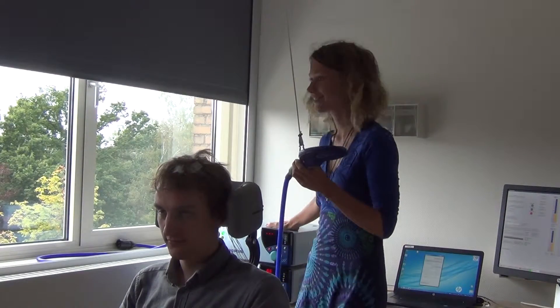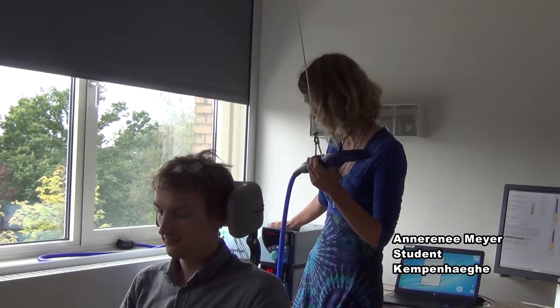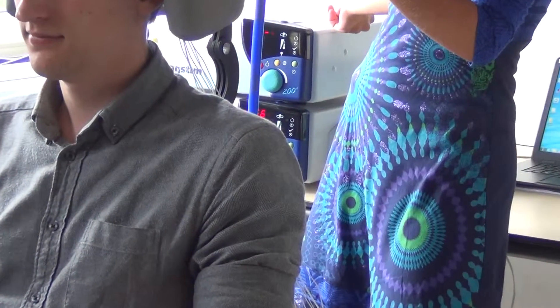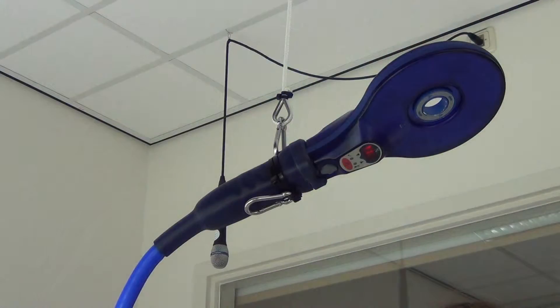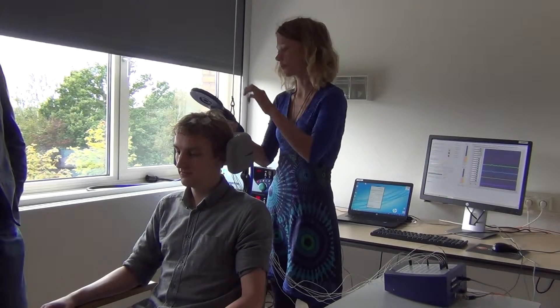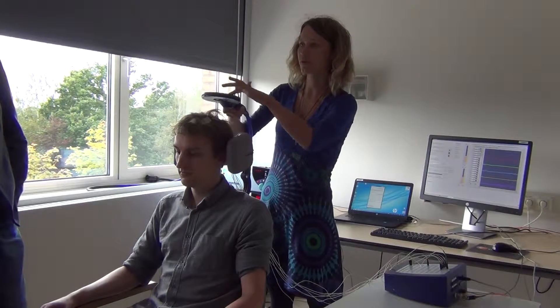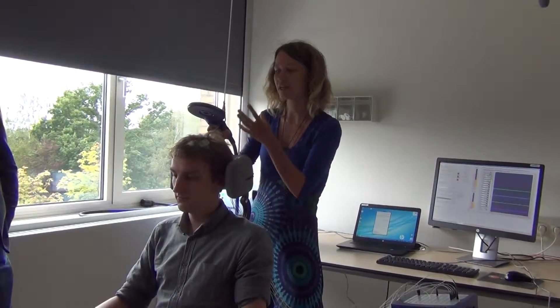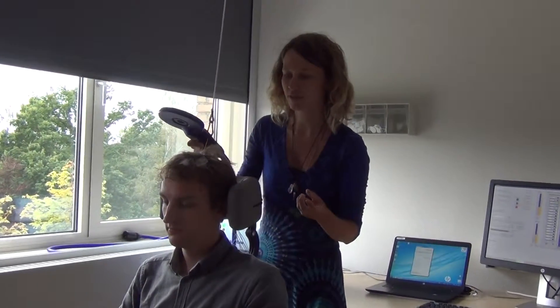If you withdraw the anti-epileptic drugs, you get seizures. I'll start over here because this is the TMS device that we use. There are two devices which both can give a current pulse towards this coil. When you give a stimulus, a pulse — a current will flow inside the coil, and when a current flows in a coil you get a magnetic field, and the changing magnetic field induces a current inside the head.